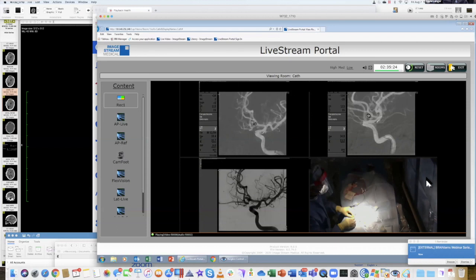See his eyes going back and forth. He's looking at the screens here. Left and right screen are these two screens, so he watches both views. He's not happy.